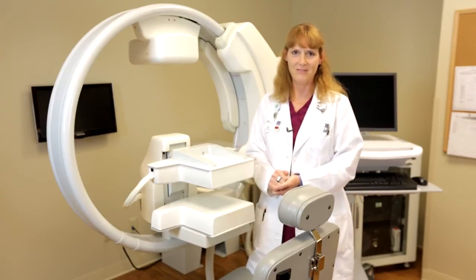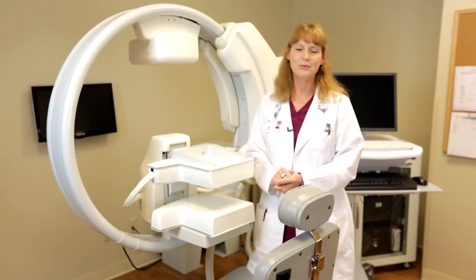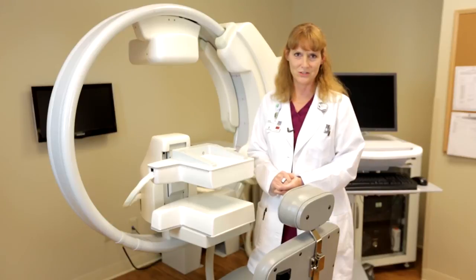Once we finish all four 10-minute pictures, total time taken about 45 minutes with positioning, we will send the images over to the radiologist workstation.